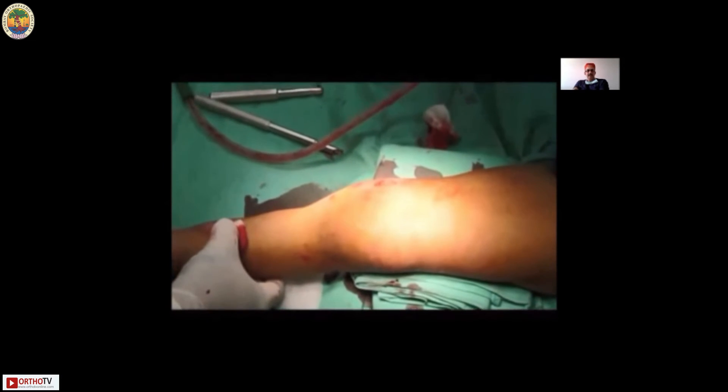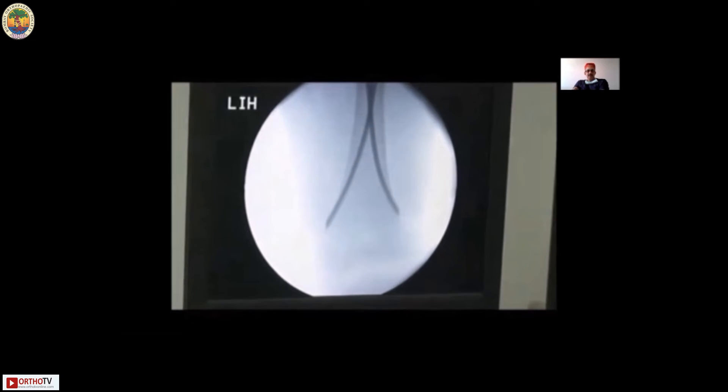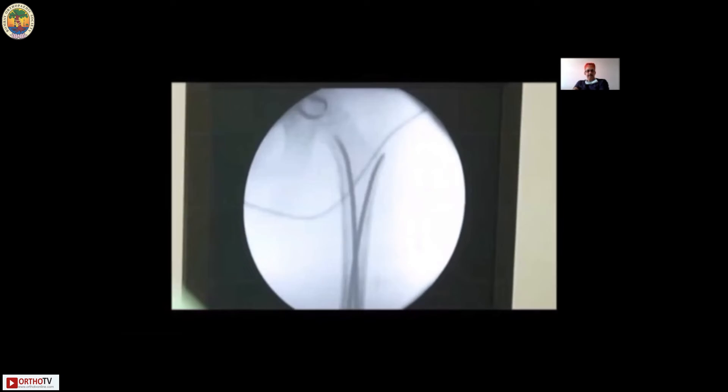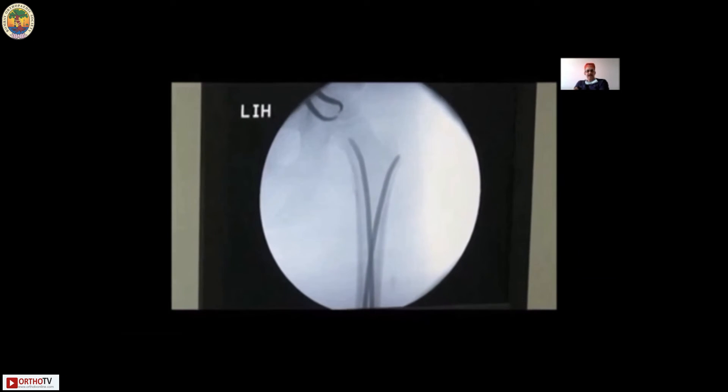When it is seated flush, you will still find one centimeter of nail lying outside the cortex for later removal. You can see it has moved proximally, the canal is well occupied with 80% canal fill, excellent spindling, and that is the seating in the neck and at the trochanter. Once you have cut both nails, check that they are away from the growth plate so you don't cause growth disturbance. The final step is flexing the knee — especially in a transverse fracture — with a gentle pump on the patella to cause a little compression.